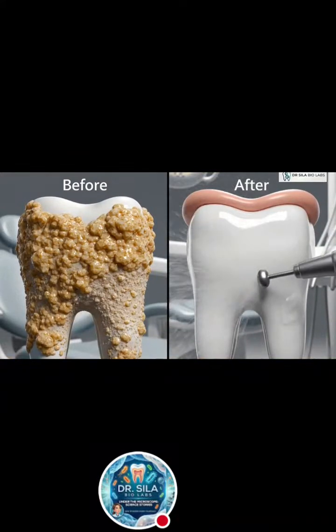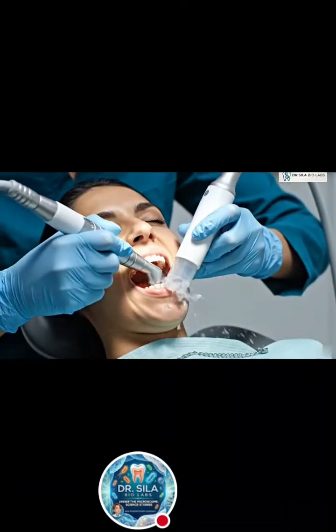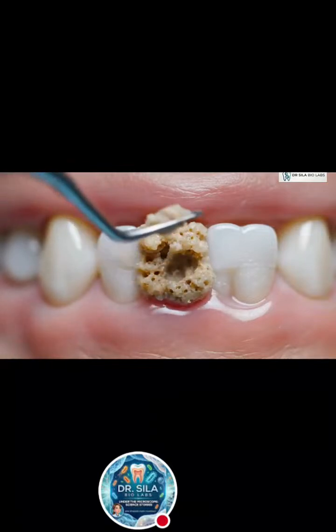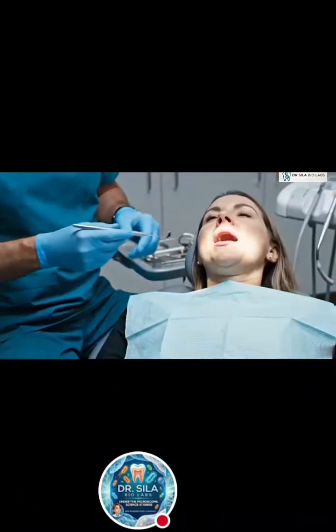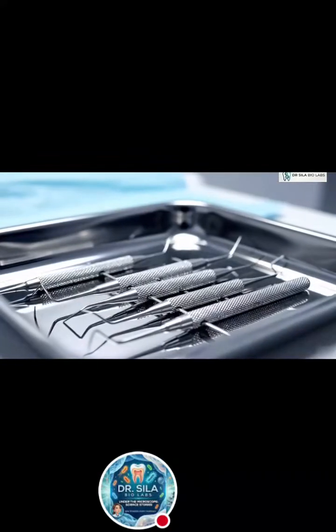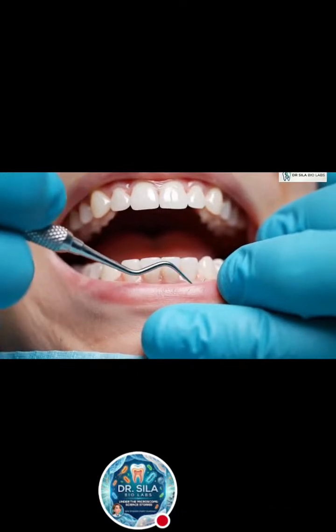Most patients experience vibration. A suction device is commonly used to keep the treatment area clear and comfortable. However, not every area can be reached this way. For fine details and difficult-to-reach areas, hand instruments are often used. These specialized instruments help achieve a thorough cleaning. In the next section, we'll explore how hand scaling instruments help achieve a thorough cleaning.